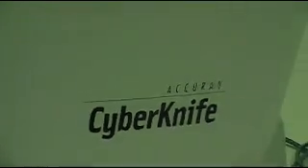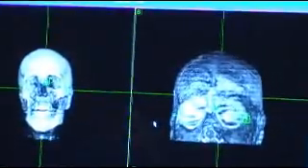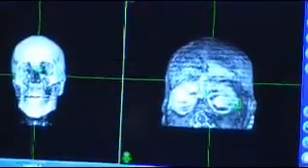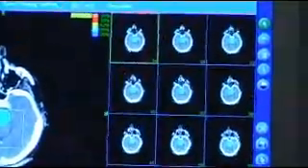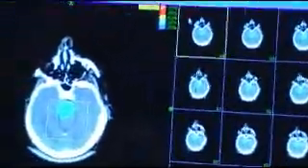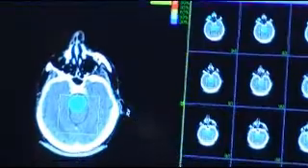This is an example of some of the technologies that we do for imaging. This is the CT and this is the MRI. We fuse them and register the images — that blending of technology, taking this type of scan and layering them together. The computer combines all of it for a great, accurate target.